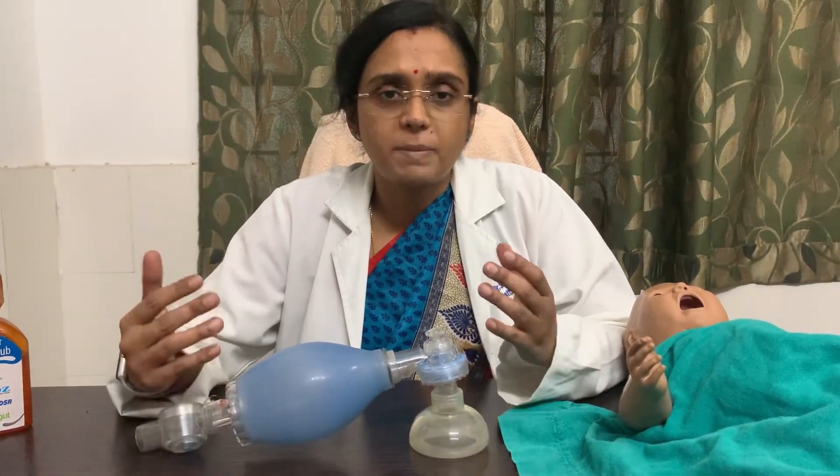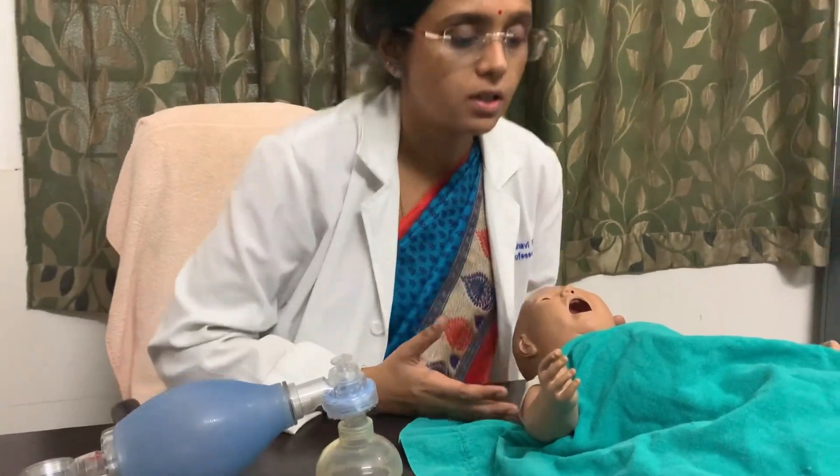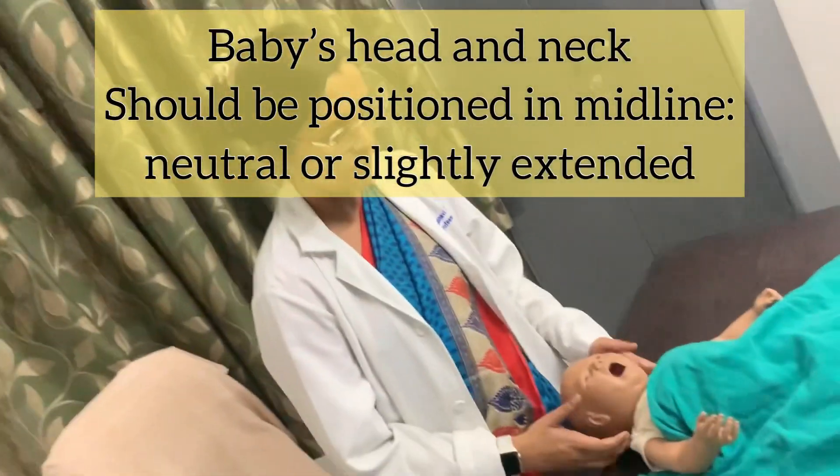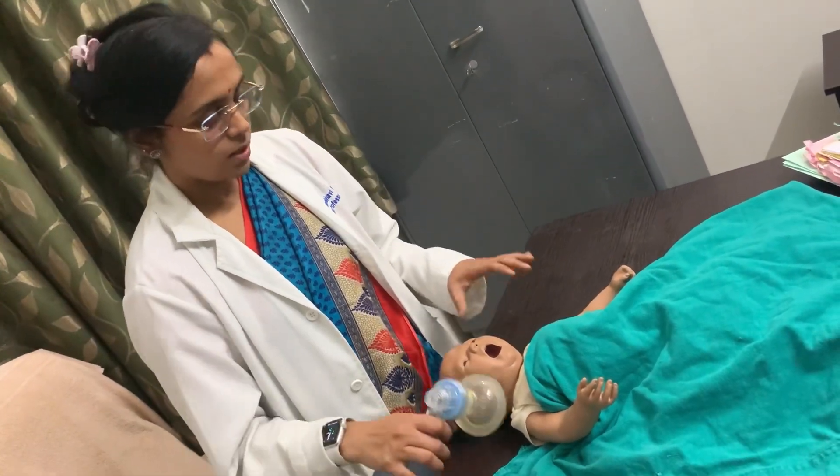Now let us see how to use it. I will demonstrate on this mannequin. Standing at the head end of the patient, extend the neck slightly. The basic concept of using bag and mask ventilation correctly is that the seal around the mouth and nose should be leak-proof.